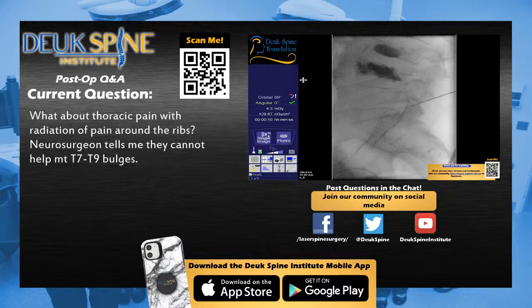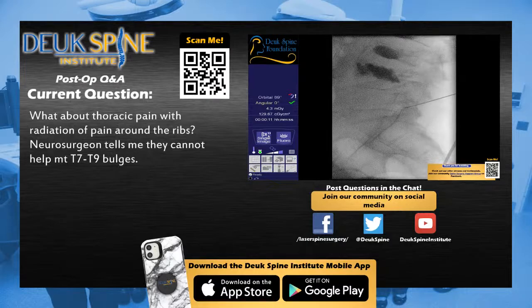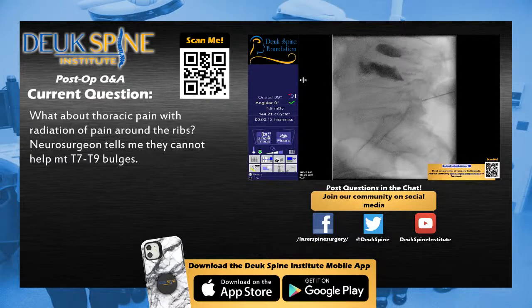So I've done this type of surgery in the neck for the cervical disc herniations and in the back for the lumbar disc herniations, but I had never done it in the thoracic spine. Why? Because A, I was never taught to do it. At least with the cervical, the Koreans were doing it. Even though nobody else in America does it, I'm the only surgeon in the United States that does anterior cervical endoscopic surgery.